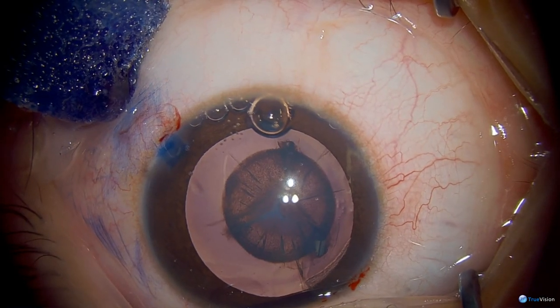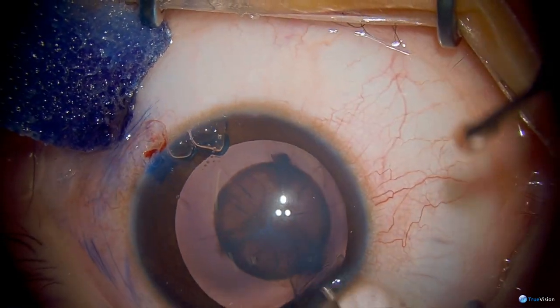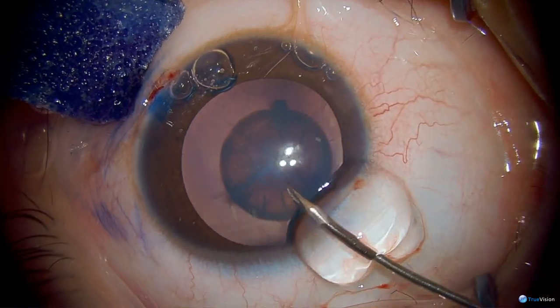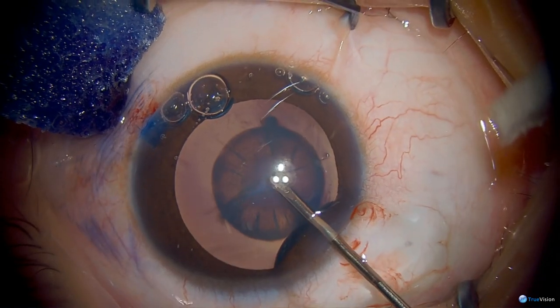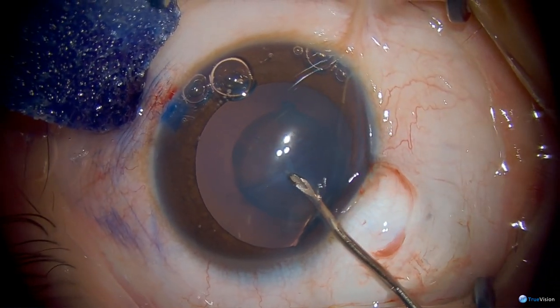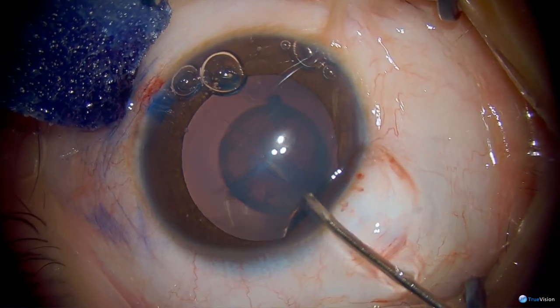Using a highly cohesive viscoelastic to keep that anterior capsule flat, and a bent tip needle cystotome to initiate our capsulorhexis, which will then tear 360 degrees. This girl is 12 years old, so it's not quite as challenging as an infant cataract, but it still behaves differently than an adult anterior capsule.